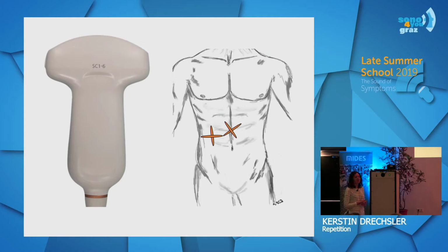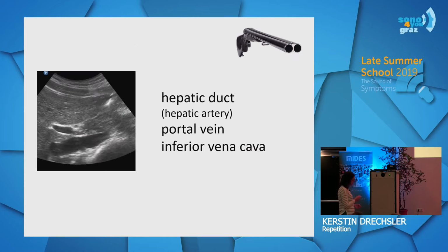So if you want to exclude extrahepatic bile dilatation, you might want to place your transabdominal array in the epigastric area, and you want to rotate it to the right shoulder of the patient. You might want to use an abdominal array, and you want to scan the gallbladder as well as the bile ducts in the liver and the extrahepatic bile ducts. So in this case, we are looking for the double-barreled shotgun sign, which means that a dilated bile duct will result in two parallel anechoic structures that quite resemble the portal vein.